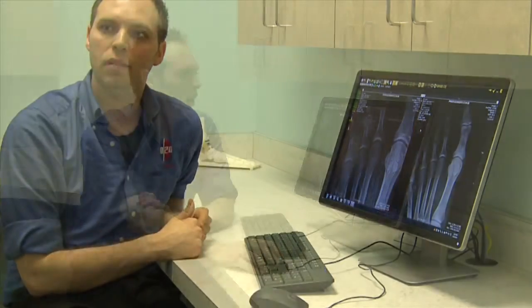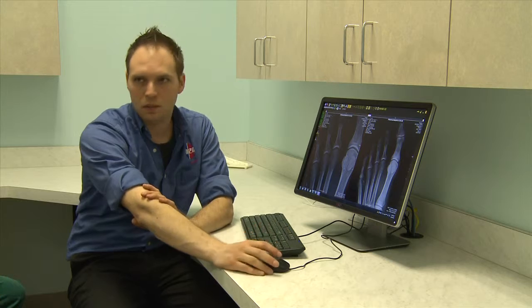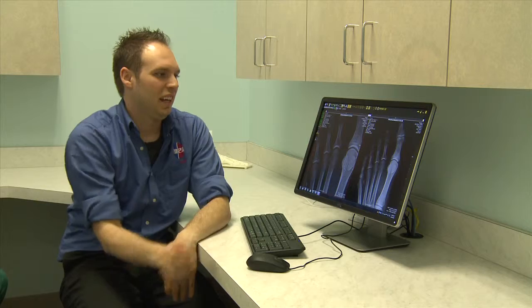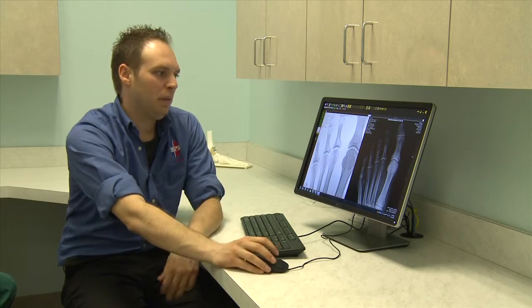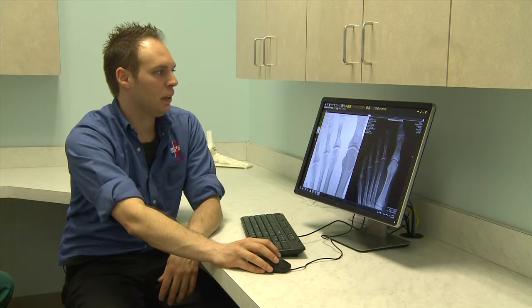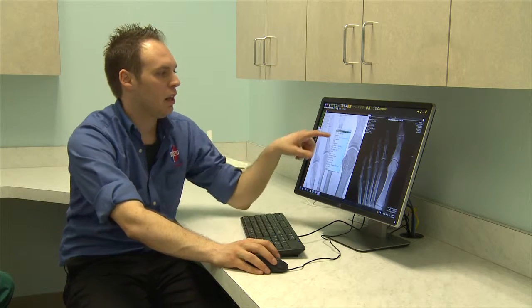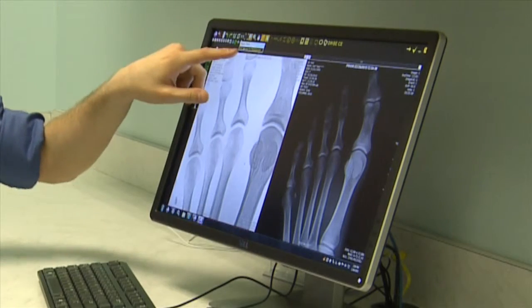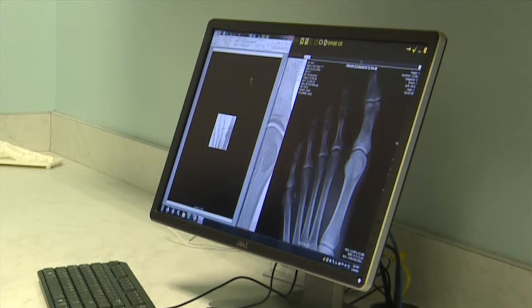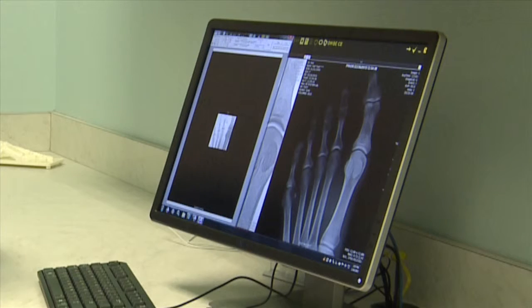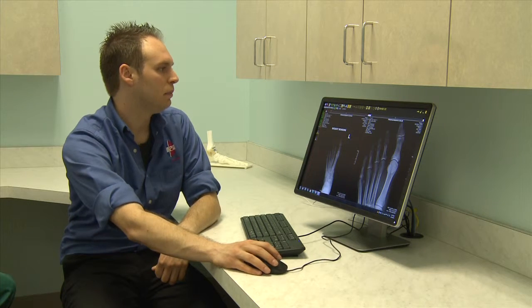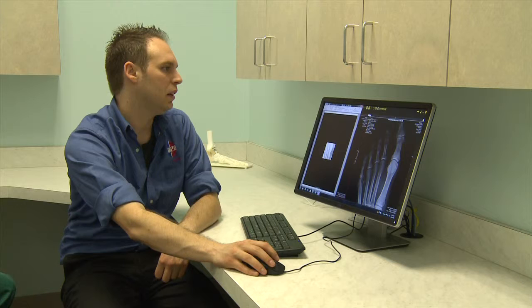You can print images, though it's not very practical. I'd recommend inverting the image before printing. You can right-click and add the image to the print queue, then go to Paper Print. Keep in mind it will still have a black background and will print what you currently have zoomed in. Reset first if you want the full image, then print.